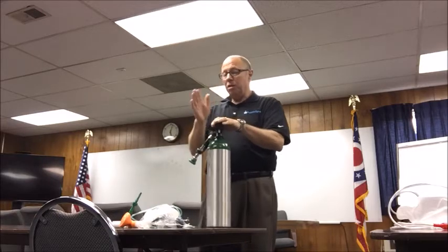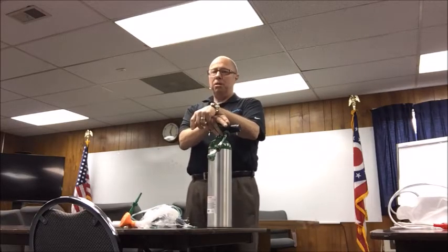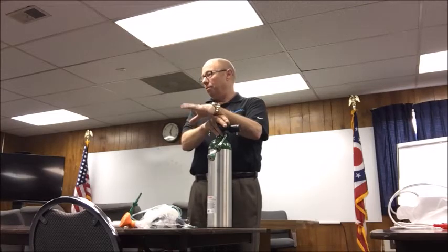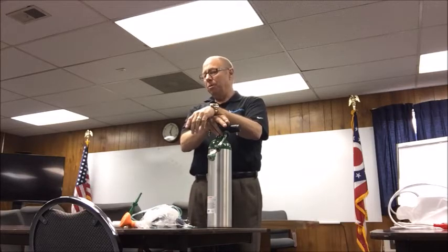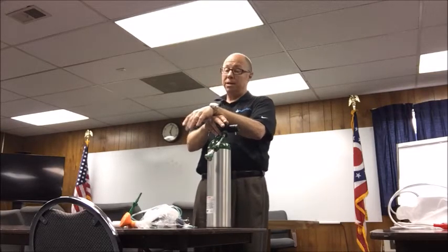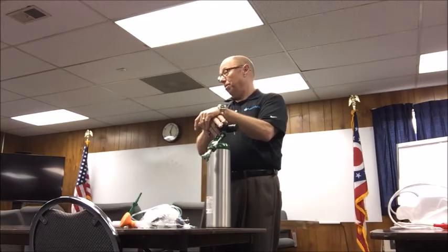The key to CPAP, and I'll say this many times during this, is CPAP needs to be started at bedside. The reason why is these people have been in distress for a long time. Some of you are frequent flyers, and we all have them. They're sitting there thinking, oh my God, I can feel my lungs filling up. I'm having trouble breathing. I don't want to go to the hospital. I don't want to call EMS because I know what they're going to do to me. I know what happened last time. They can be 35, 40, 60 minutes into the episode before they call us.